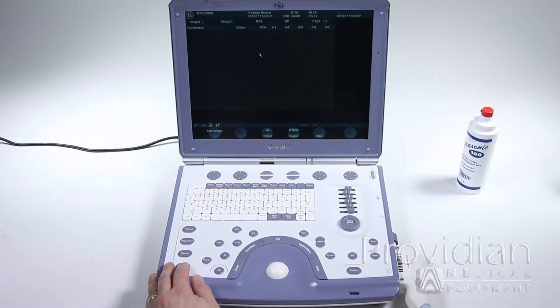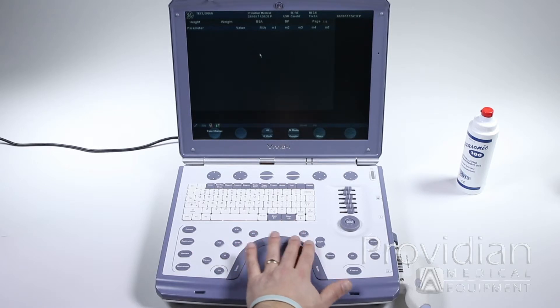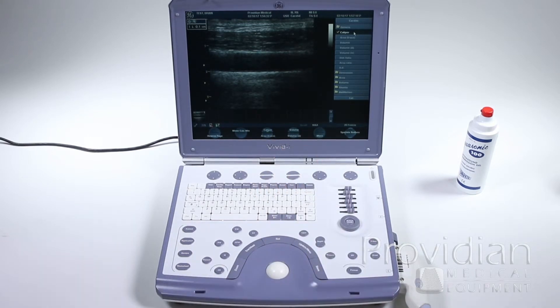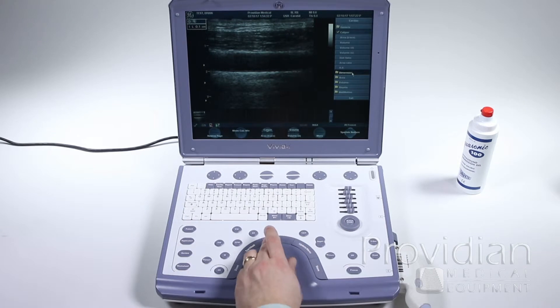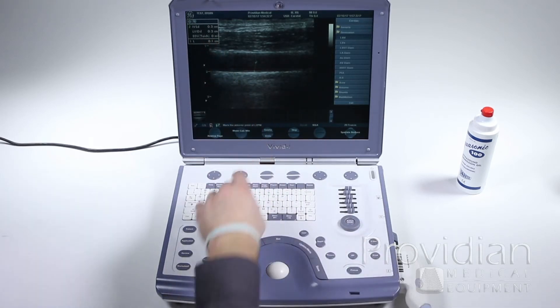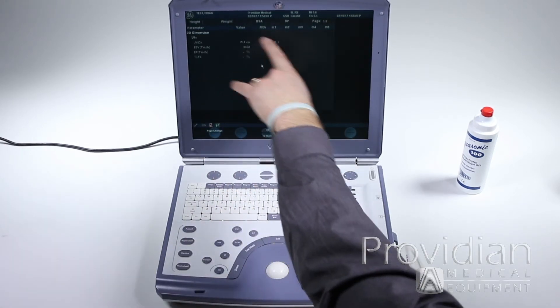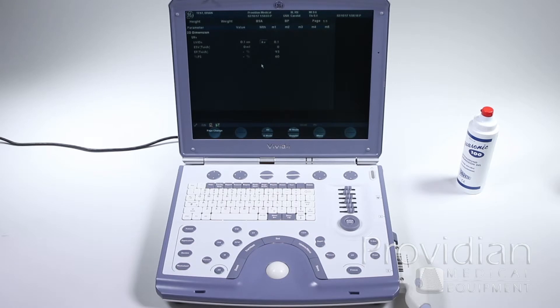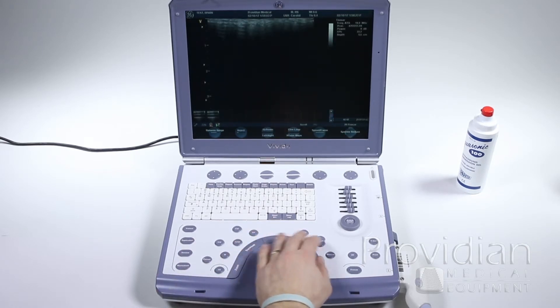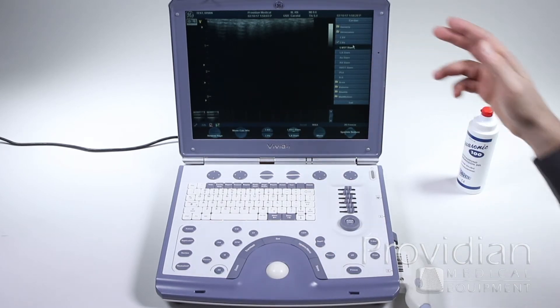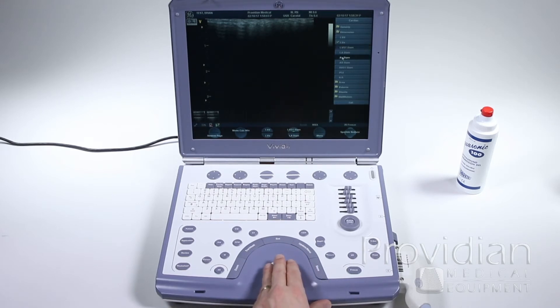It didn't really assign it — it's not going to be on the worksheet or anything of that sort because it's just a simple measurement. When you do any sort of unnamed distance measurement that's not associated with a calculation, all you're going to get is that on screen. You won't get anything on the report. In order to get something on the report, you need something specific — like a labeled measurement across a structure. It needs to have a specific label that would technically be a calculation or some sort of body part, like aortic diameter.